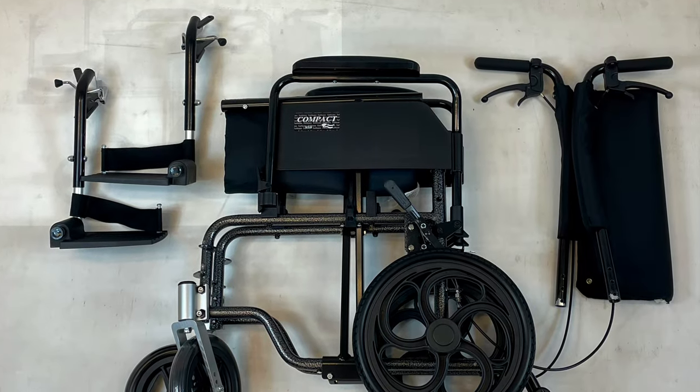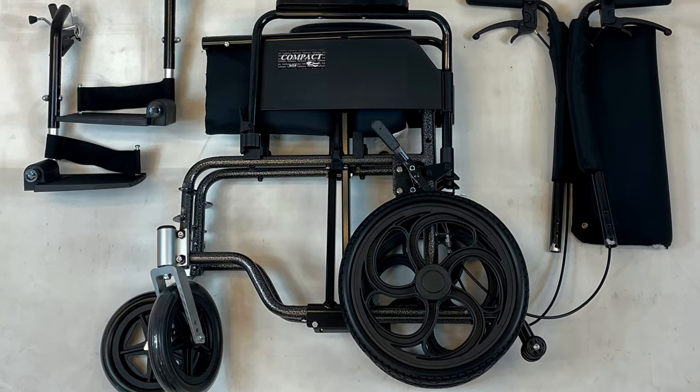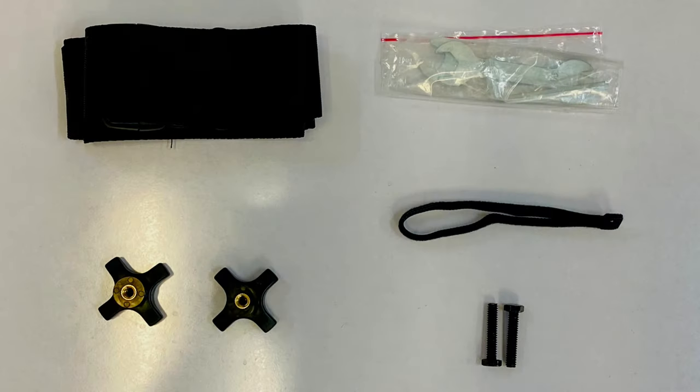Included in this product are the main frame, leg rests, and a backrest. It also comes with a seat belt, tools, velcro wrap, screws, and knobs.